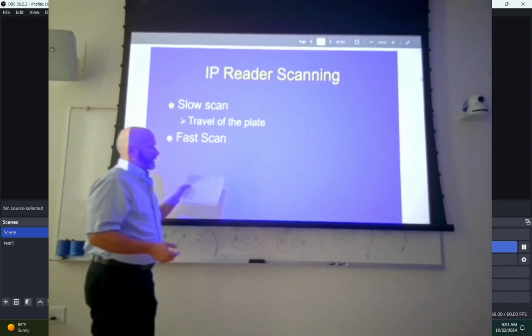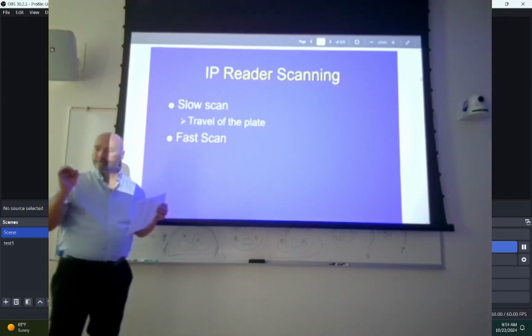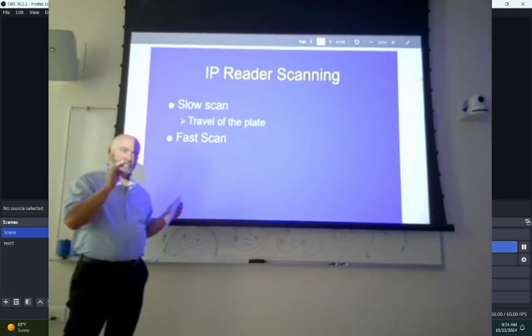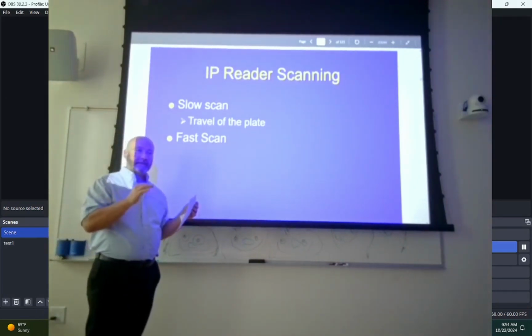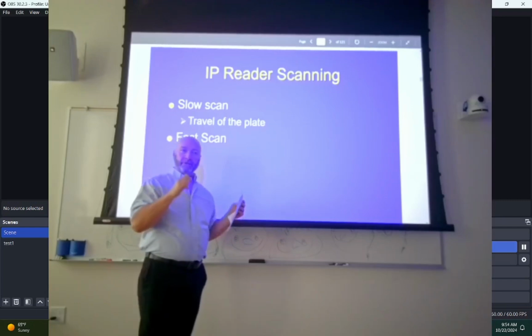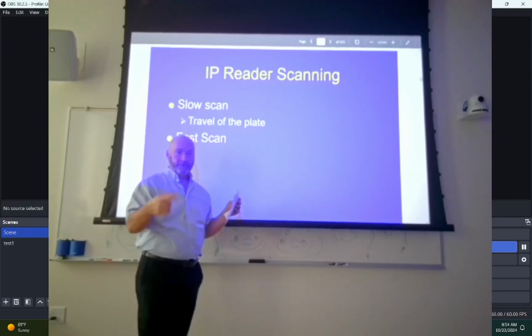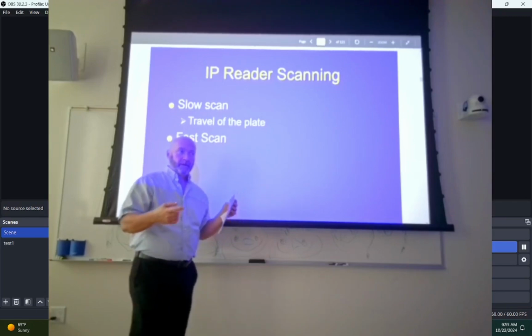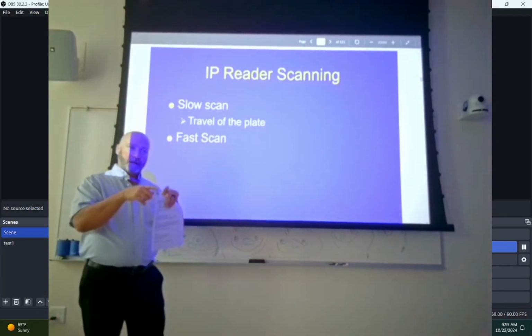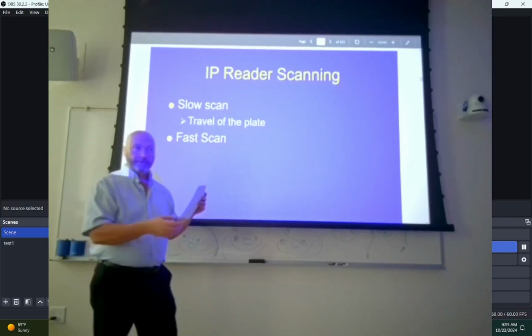The problem that you run into is a number of different things. First off, the width of the laser has to be consistent, and it has to be very small. Preferably, you want each individual phosphor to have its energy released at a time. If you release the energy out of two of them at one time, then the light tends to blur together, right?